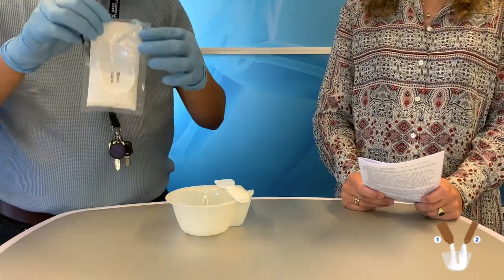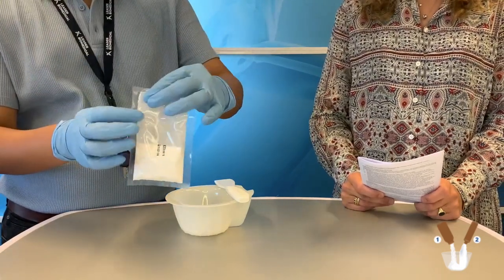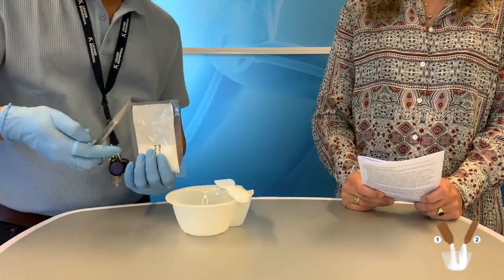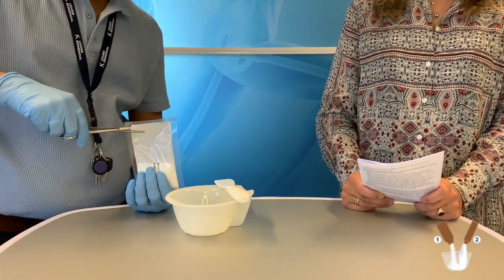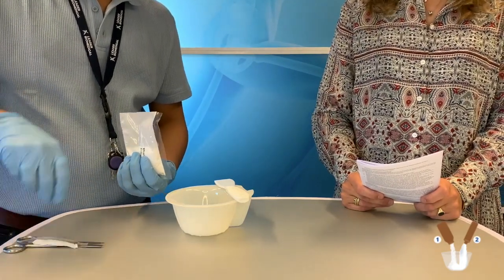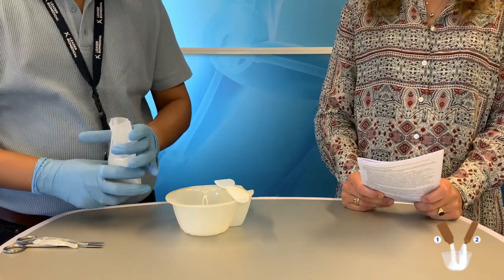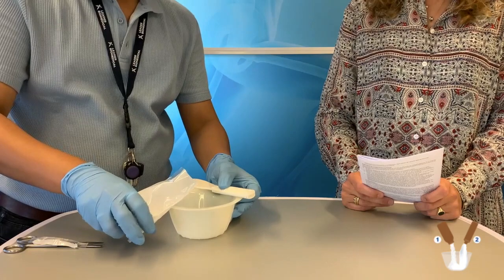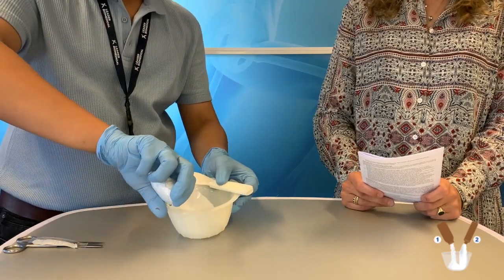Next we open the pouch with a pair of surgical scissors. Gently you pour the powder into the bowl, which contains the liquid.